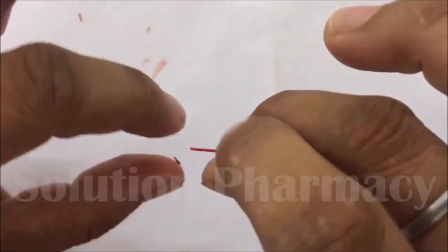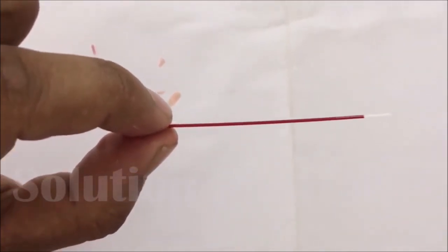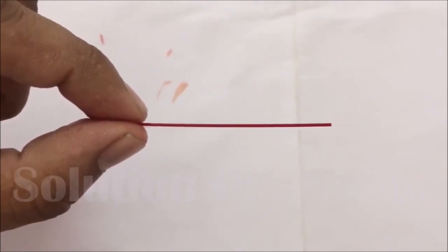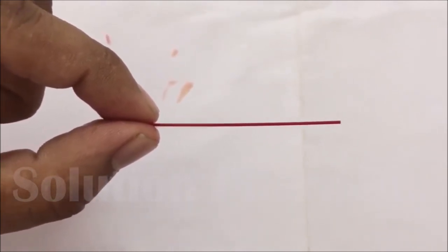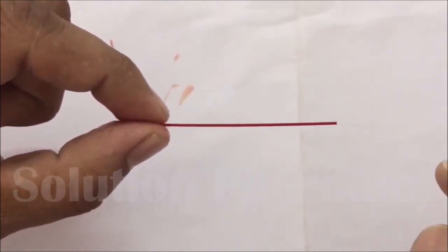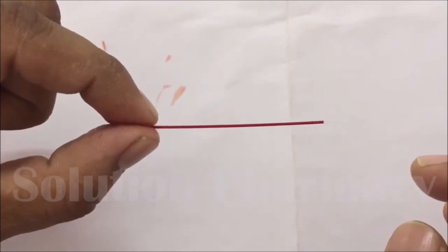We have to repeat this process at an interval of 30 seconds until we observe a fine thread of clotted blood after breaking the small pieces of the capillary tube. Clotting time is the time between the appearance of blood in the finger and the formation of the clot, and this is called the clotting time of our blood.